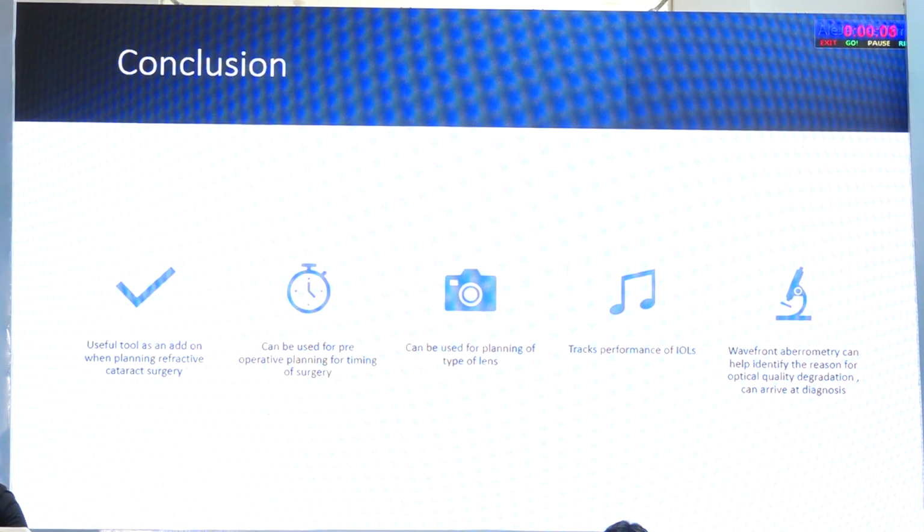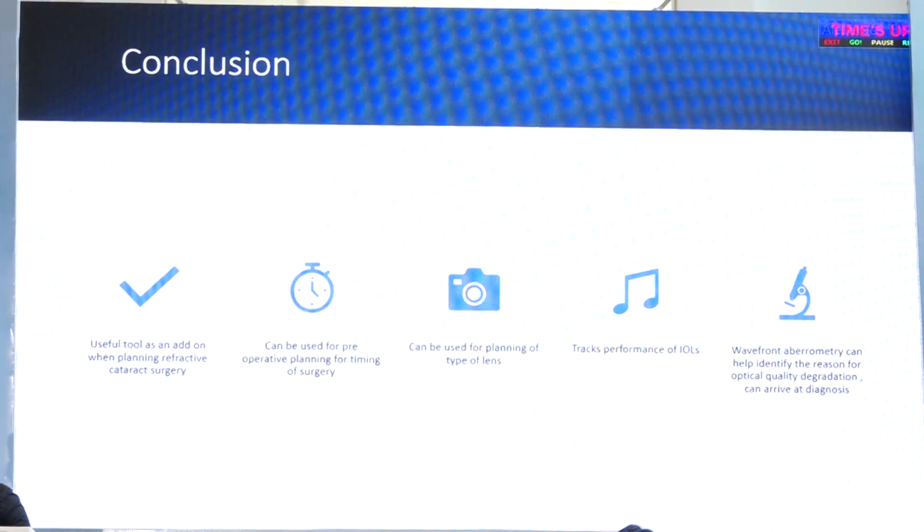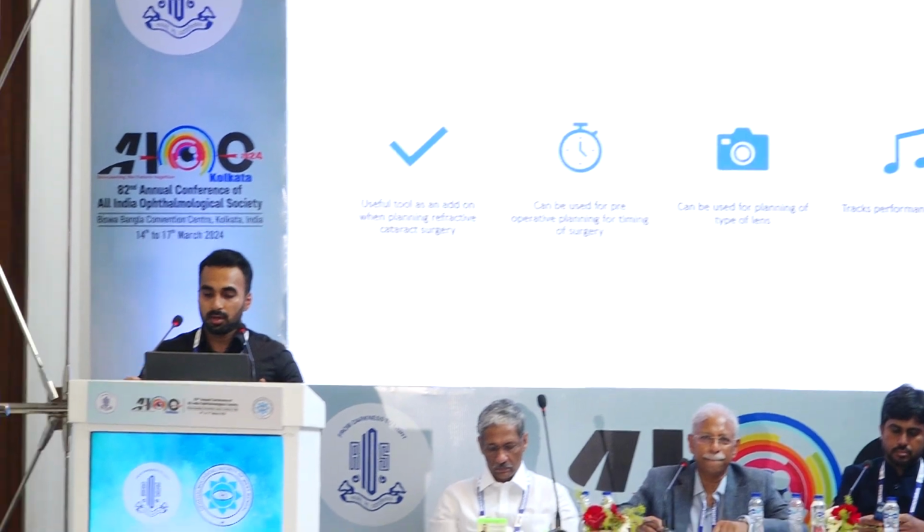So to conclude, aberrometry is a useful tool when evaluating a patient for refractive cataract surgery, helps you in your decision making in the preoperative period. It can also be used to plan, and you can track your outcomes with the IOLs. You know which IOL gives you what outcome. You can see the contrast sensitivity. And the wavefront aberrometry can not only help you in the pre-op planning, but also can help you in post-op troubleshooting and help solve patients who are having those odd issues.